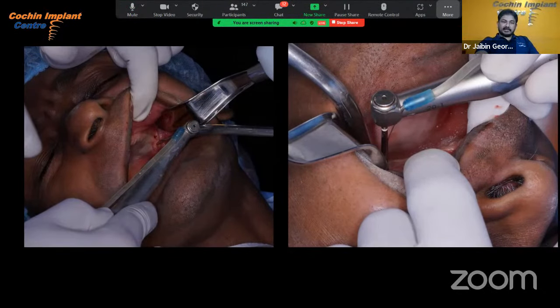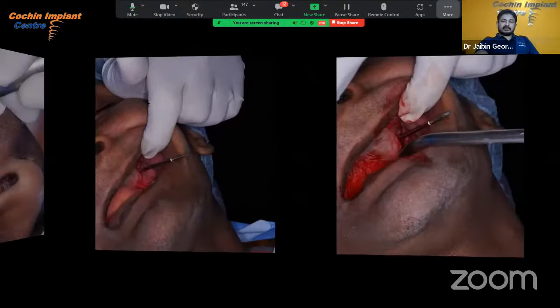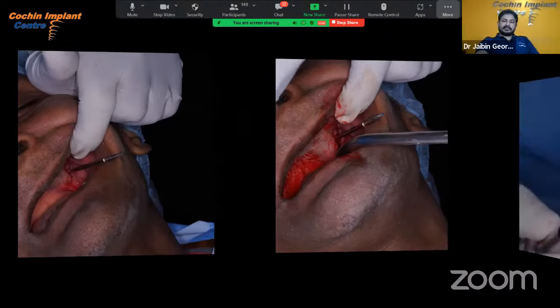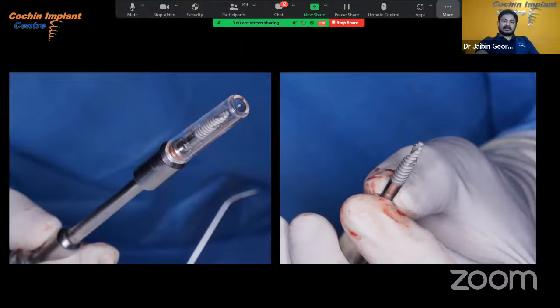First, we started with the pterygoids. We are placing the pterygoid implants. So this is the pterygoid surgery. You can see the drill position. This is how we angulate the pterygoid implant. These are the implants. A 22 millimeter long implant we placed in this case with a polished collar.